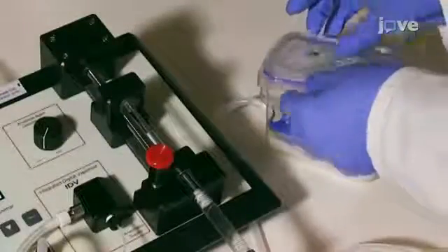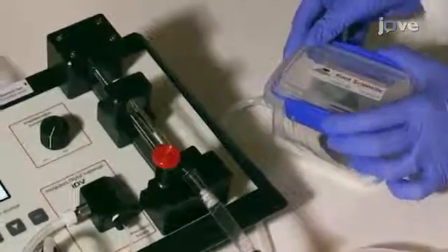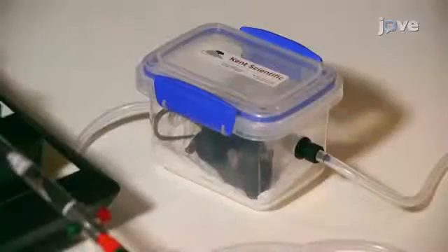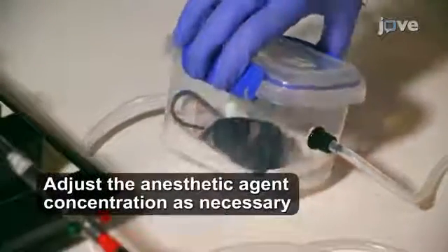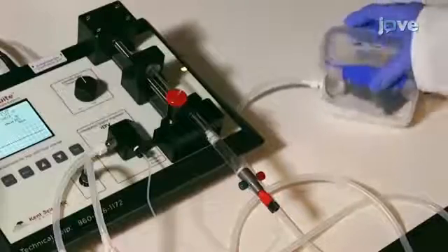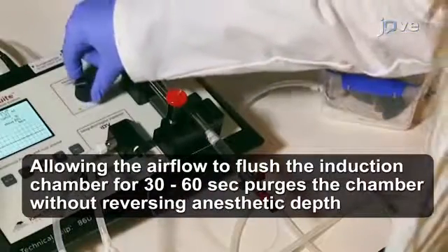Place the mouse in the induction chamber, close the lid tightly, and adjust the anesthetic agent concentration dial to deliver 3%. Monitor the mouse until it reaches the desired plane of anesthesia determined by loss of the righting reflex. Once the animal is sufficiently anesthetized, turn the anesthetic agent concentration dial to deliver 0%.